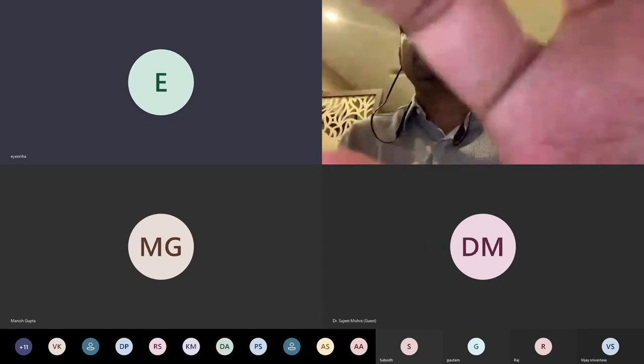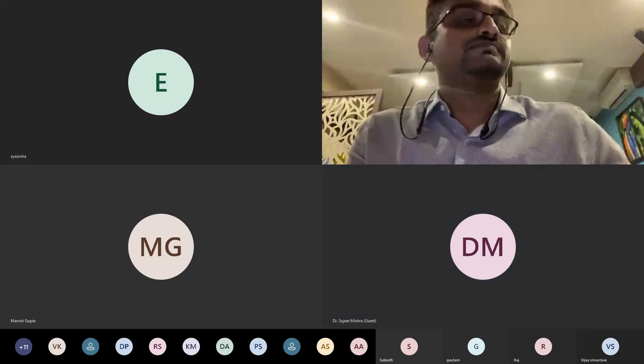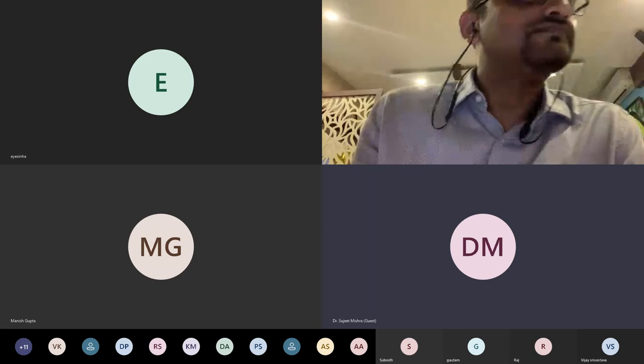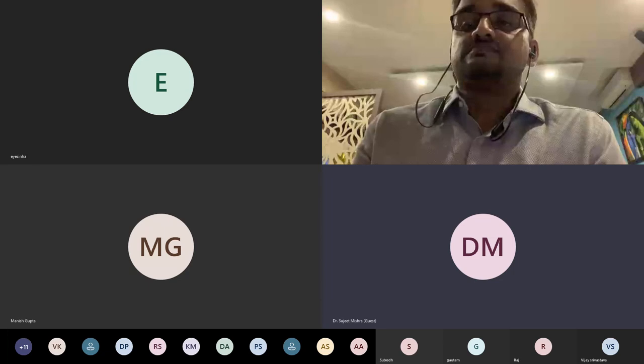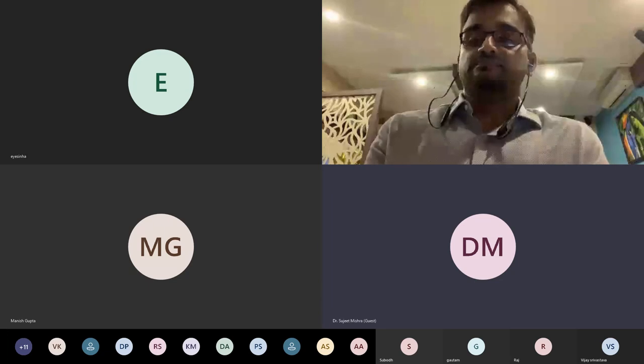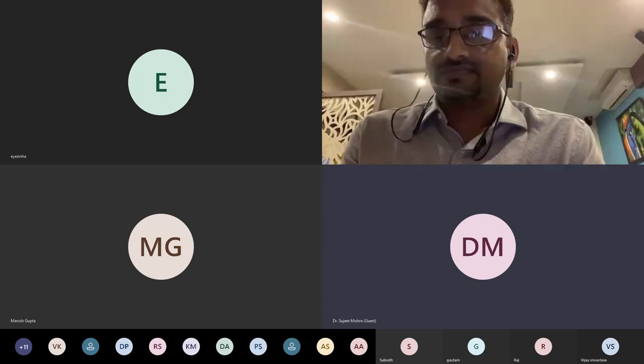What is the concept behind the Hill RBF formula? Yes, sir. Hill RBF, RBF is radial basis function, which is used in engineering basically. The point of measurement is kept fixed and the distance beyond is kept open. Depending upon the kind of eye it is seeing, it will have a pattern recognition. It is an ongoing thing. Data will be kept adding on to it, which is why it is very important. It will recognize almost all kinds of patterns. It's based on artificial intelligence.